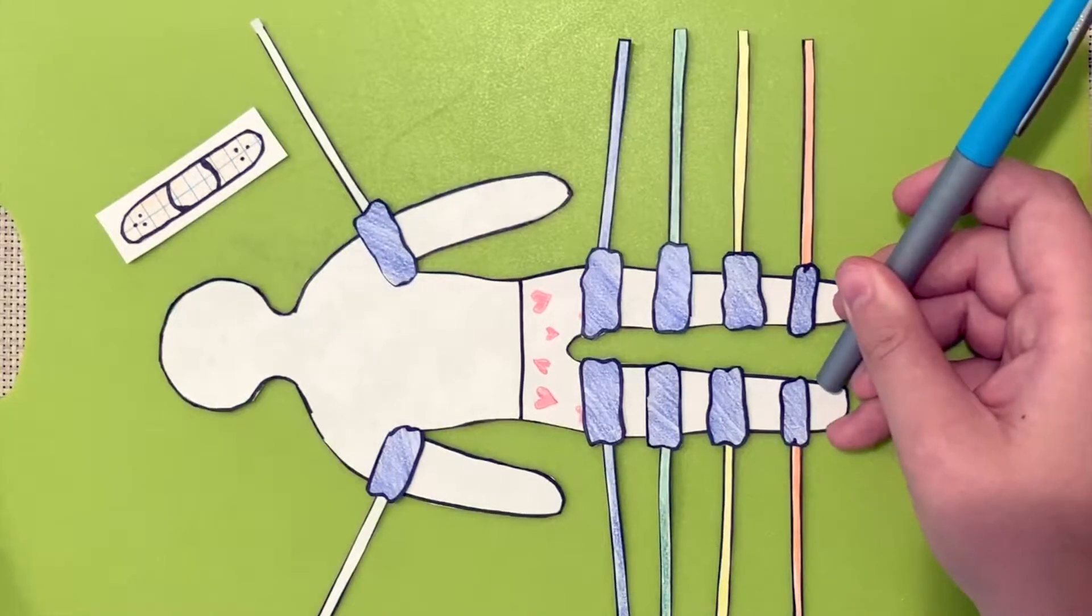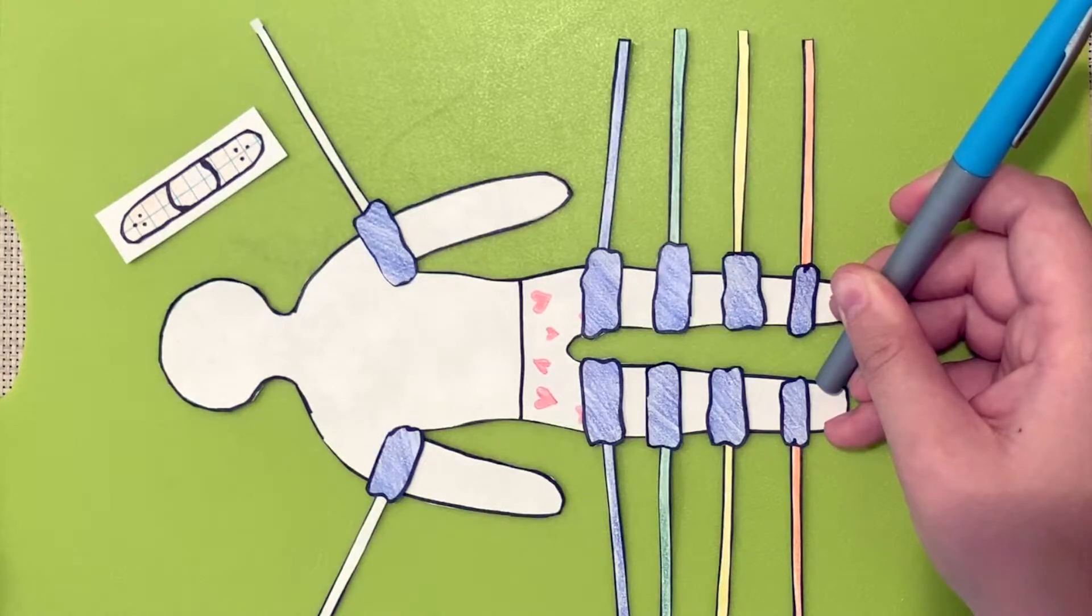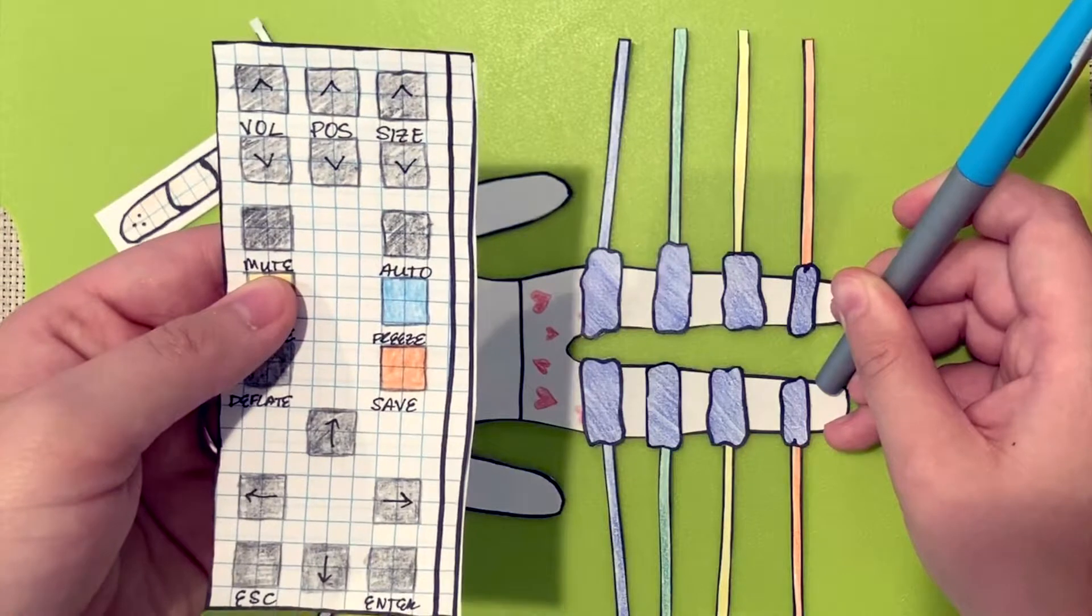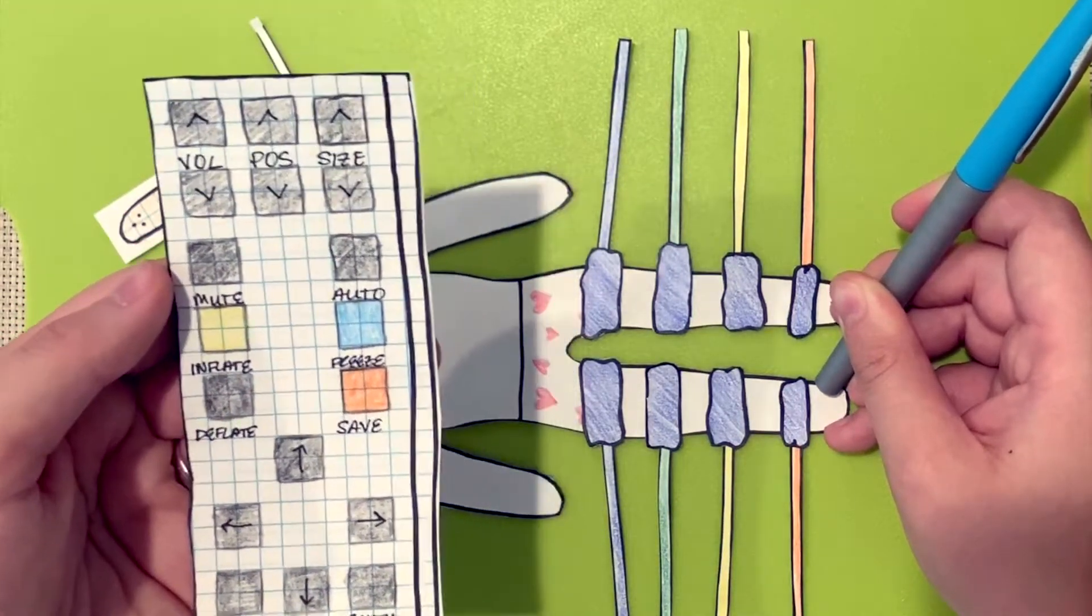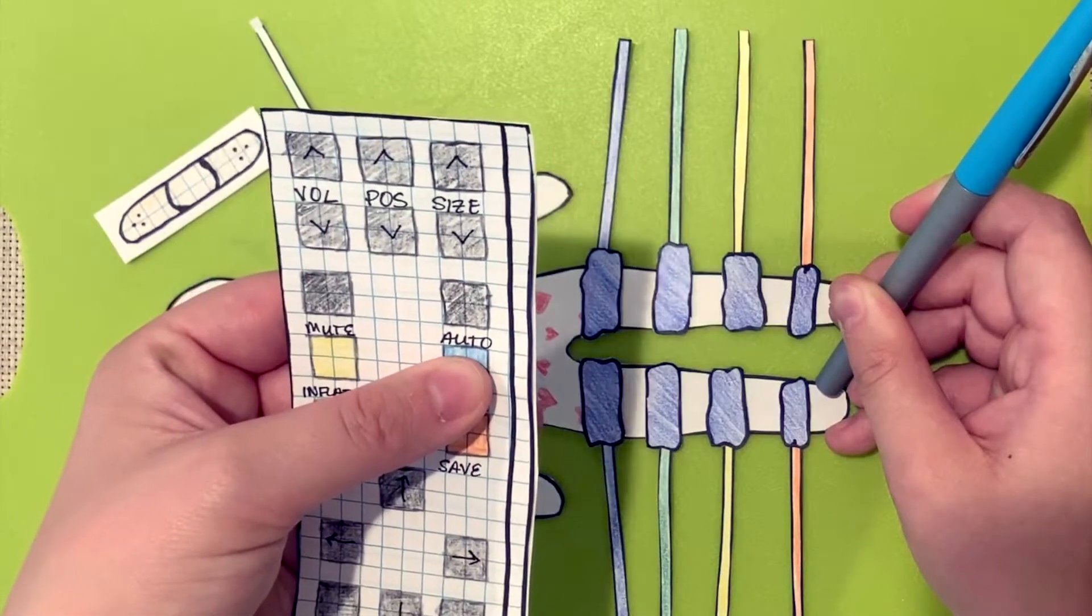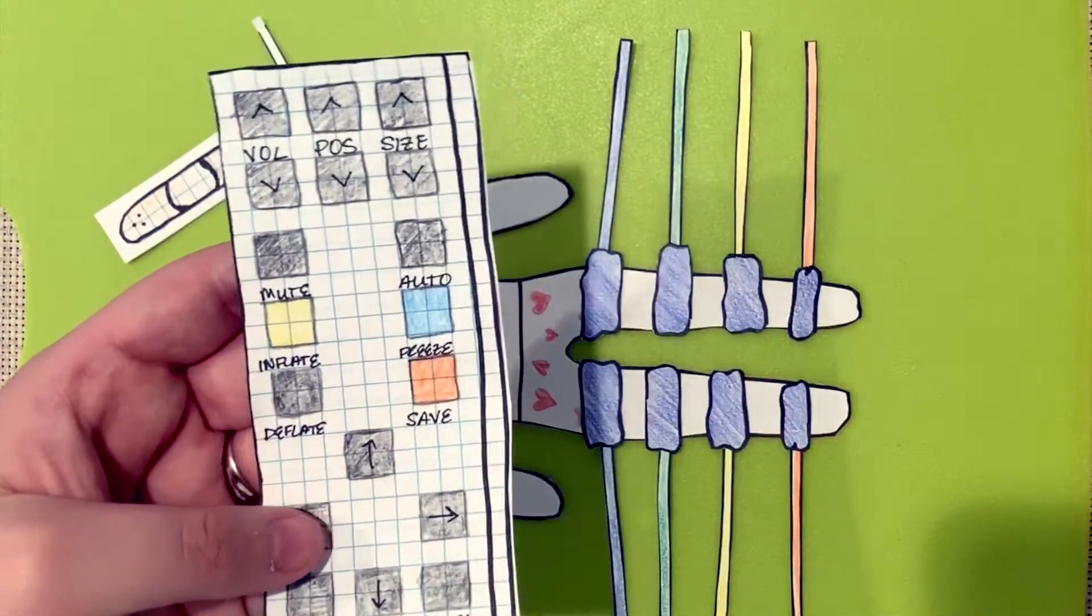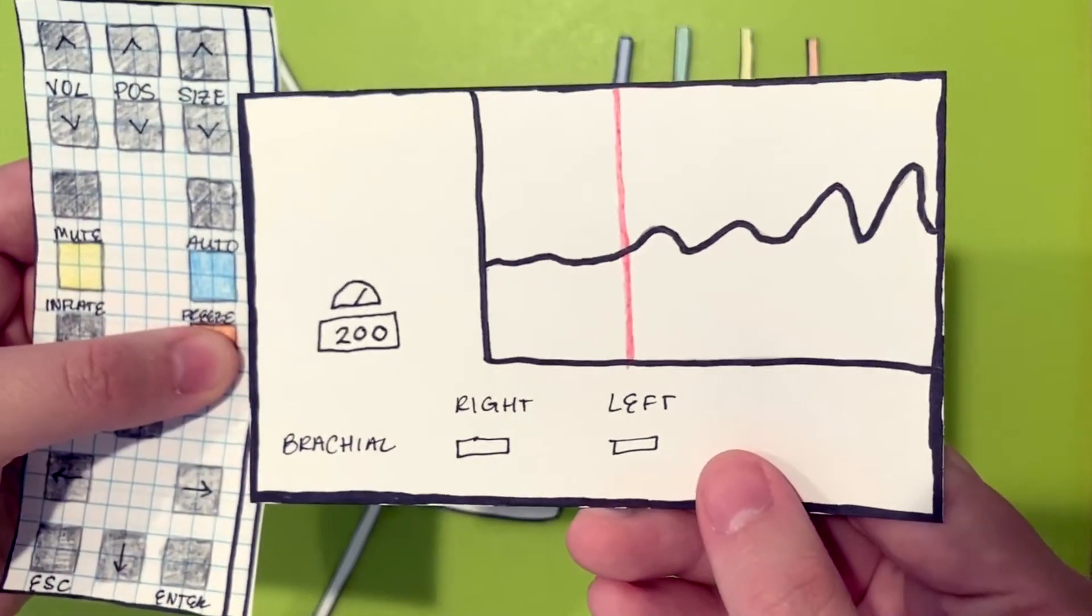After locating a strong signal at the posterior tibial artery, you will use the remote to inflate the cuff. Hold the inflate button until the signal is gone and then release. The cuff will bleed back on its own until the signal returns. Freeze the frame and quickly deflate the cuff. You will then scroll back to the first pulse and acquire that pressure with the save button on the remote.